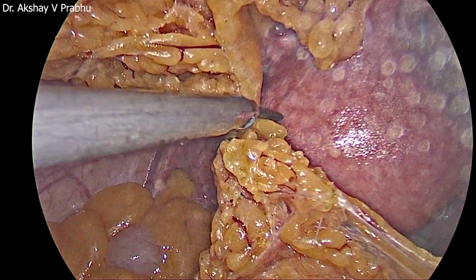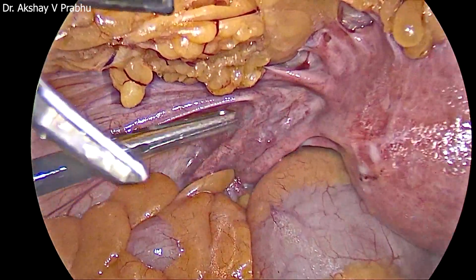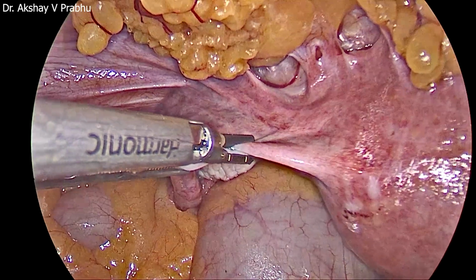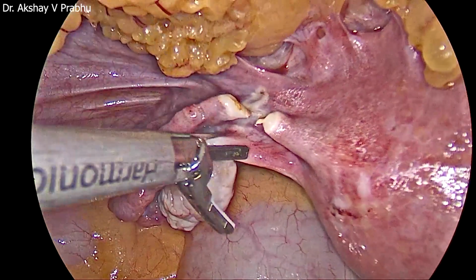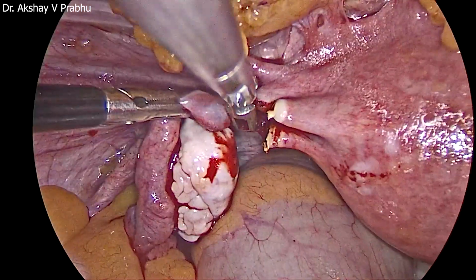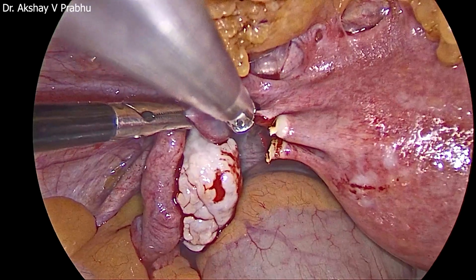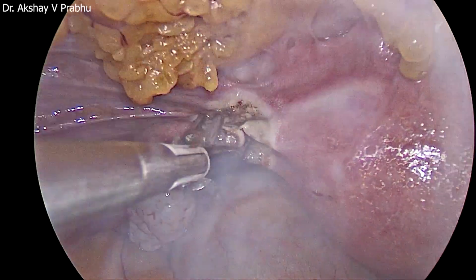This kind of picture is becoming more and more common these days because of the rampant increase in the incidence of cesarean. So in these cases, the principle is actually simple. Always go from the normal area to the abnormal area. Don't try and tackle the adhesions first, because the adhesion area, the abnormal area, is some place where you don't know what is the anatomy there. So go with the familiar aspects.